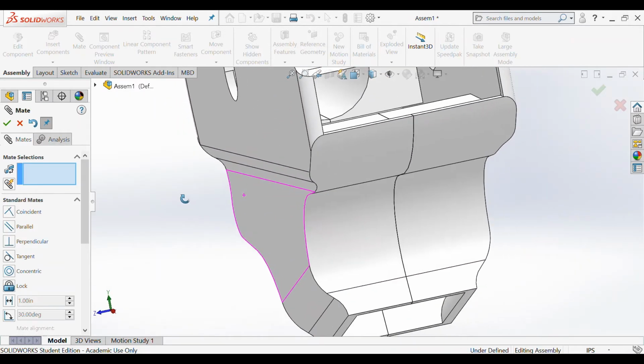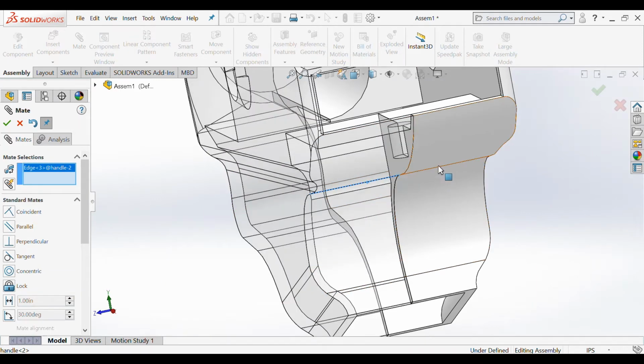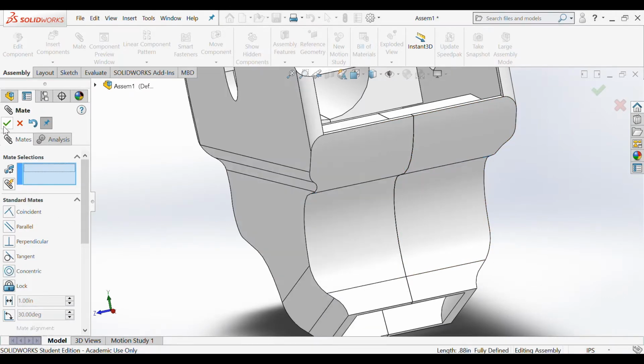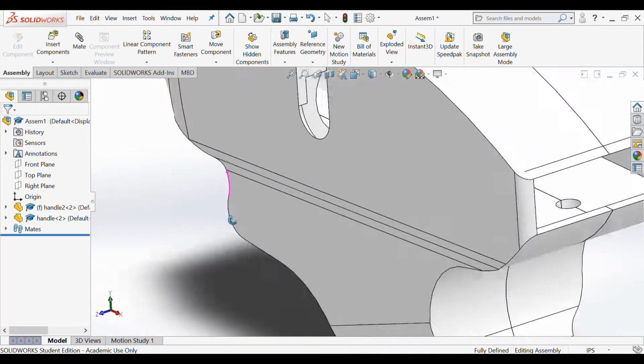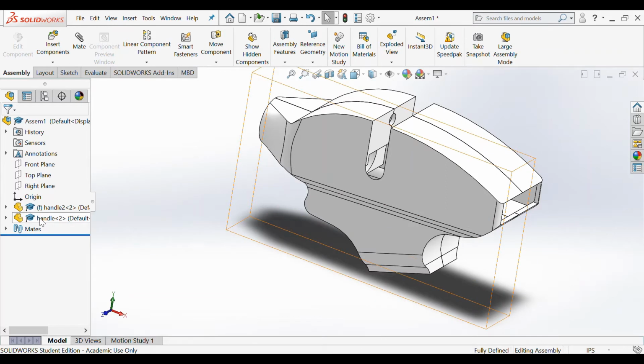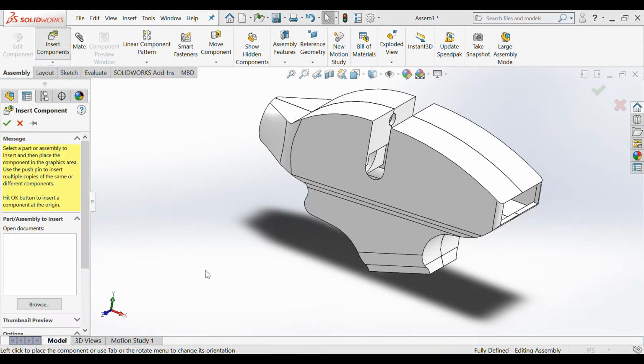And then we're going to go on ahead and look at these two edges. So I'm going to click here and click here and make them coincident. As you can see, the two pieces are together and they are fully defined. So now I'm going to insert the bottom piece to the handle.